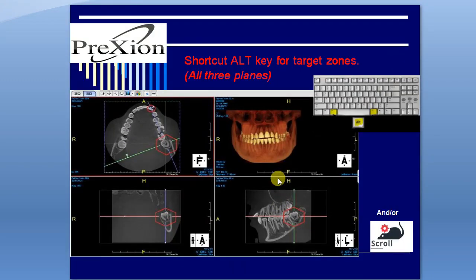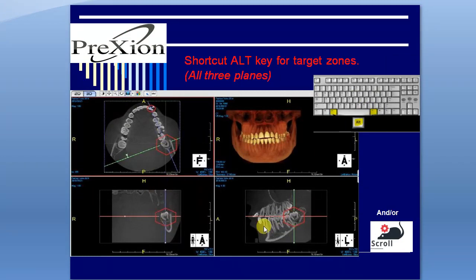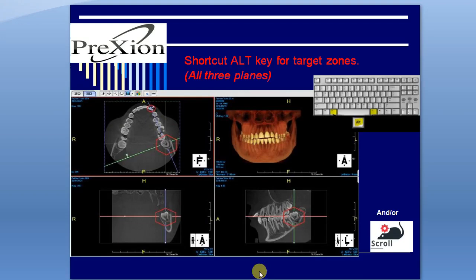We will discuss the ALT key for targeting 3 areas in the images. The ALT key on your keyboard targets all 3 planes.